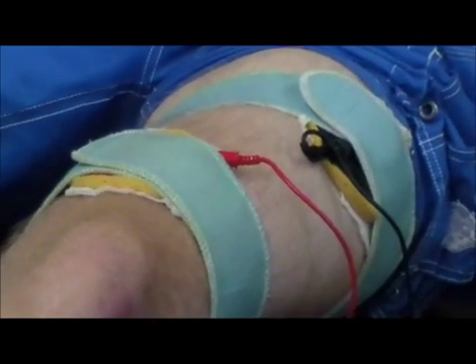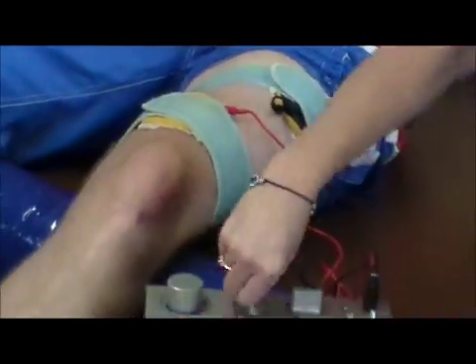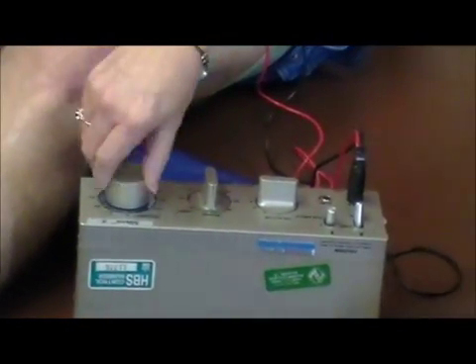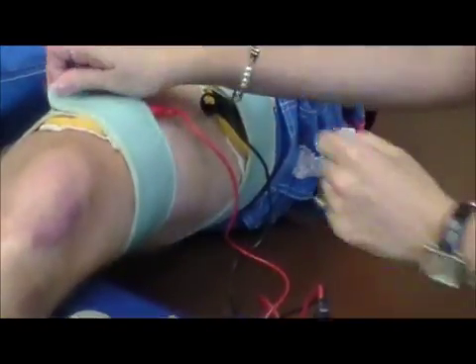I think Hannah should go now. Okay, so if you want to do this just to feel what the different selectors feel like, that's fine. And then in your groups, think about, what if I was treating this? What setting would I use? Where would I put it? Within your time, get a feel for it and then do some problem solving thinking about how you would set the patient up, how you would place these.